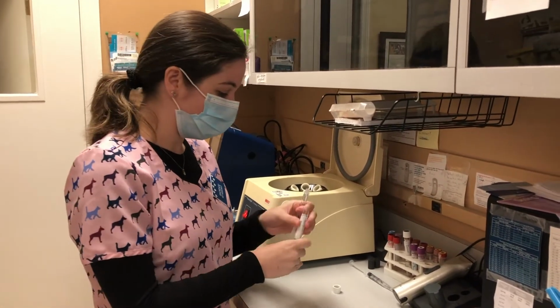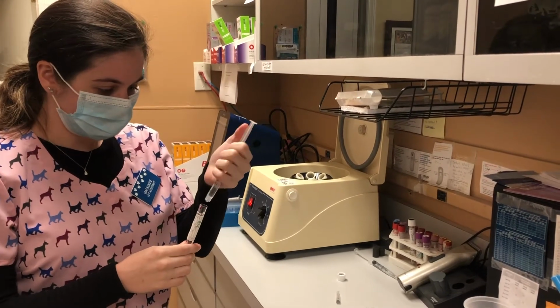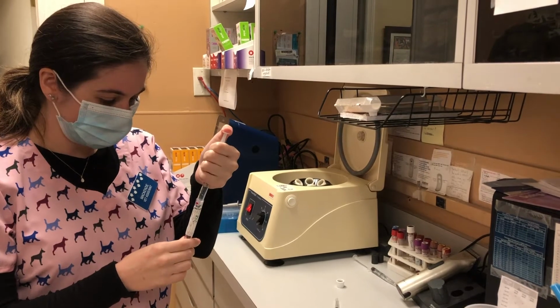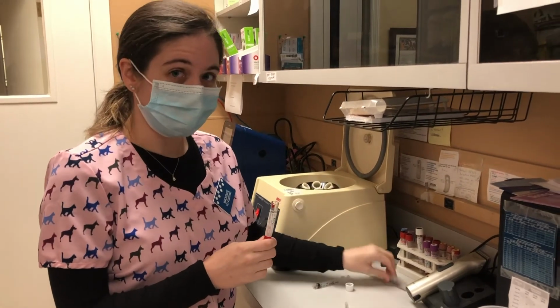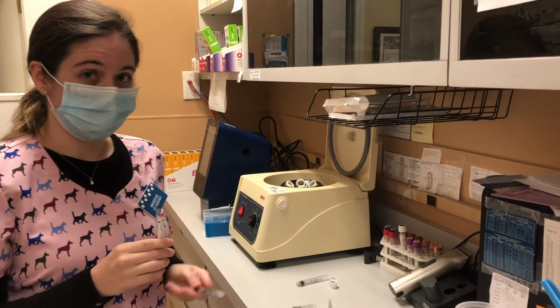I'm going to fill up the whole tube. This is known as erythrocyte washing. I'm going to centrifuge both of them for about a minute at 3,400 RPM, and then once we're done, we'll move on to the next step.